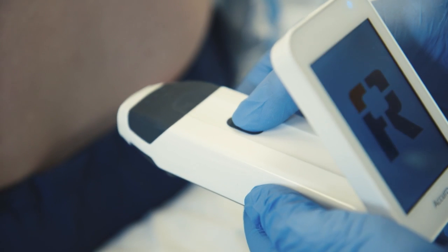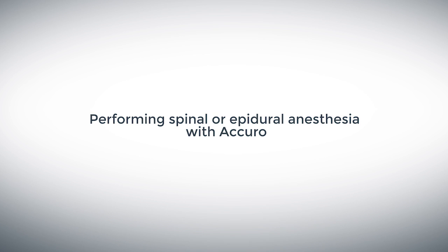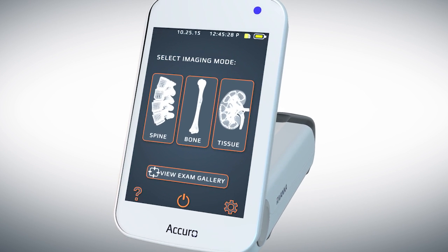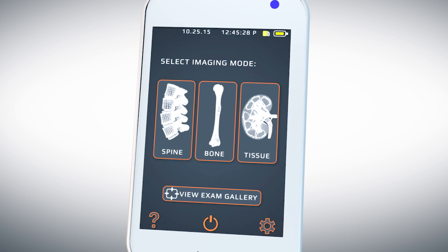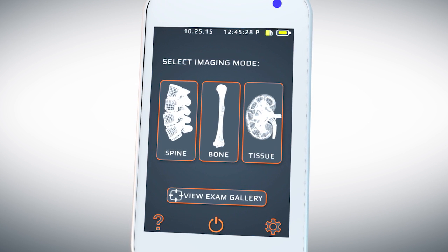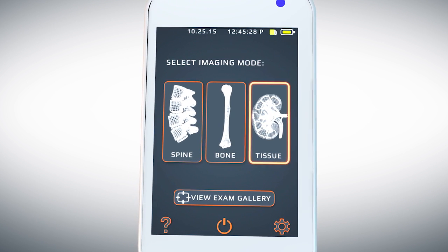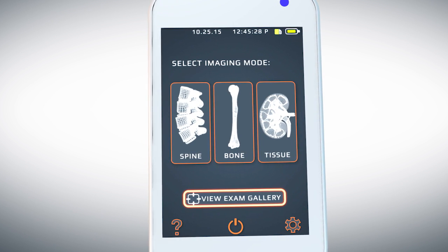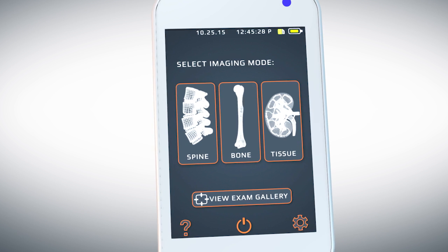The Acuro is powered on by pressing the power on/off button. After the Acuro finishes powering up, the home screen will appear. From the home screen there are three different presets from which to select: spine, bone, and soft tissue. The home screen also provides access to saved images in the gallery, which will be demonstrated later.